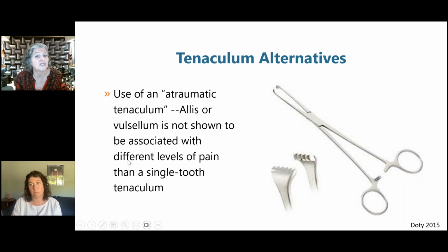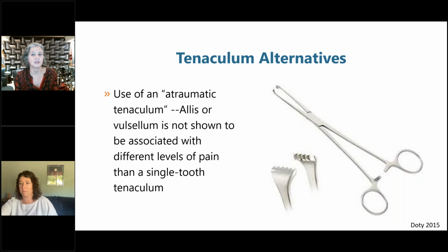What does make a really big difference with tenaculum, in addition to the other tips we're going to tell you in a minute, is not spending any time trying to stop the bleeding. If the patient understands there may be some amount of light bleeding after the IUD placement, or heavier bleeding if they have their menses, then what we expect is that whatever little hole or holes were caused by the single tooth tenaculum may cause some bleeding, even if there's a little cut on there, it's still going to stop bleeding when the pressure of the vagina is against the cervix when you remove the speculum.